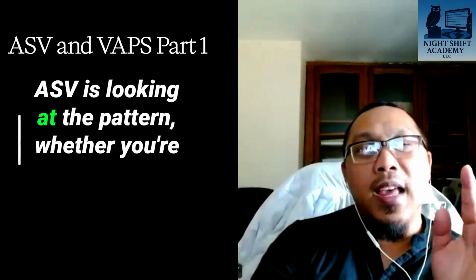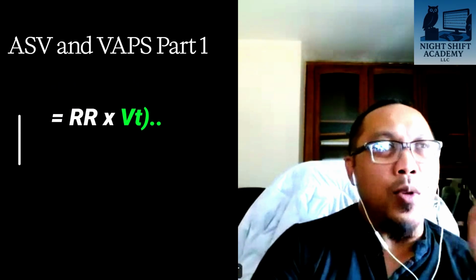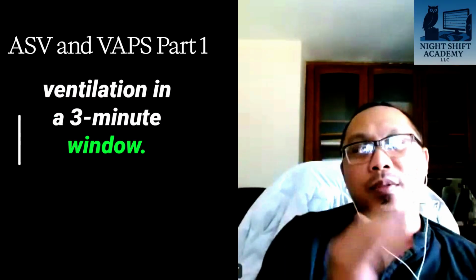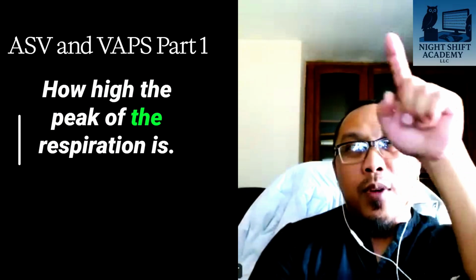ASV is looking at the pattern, whether you're using Philips or ResMed. One will look at minute ventilation, meaning respiratory rate and tidal volume. It will look at the patient's own minute ventilation in a 3-minute window. Philips will look at the patient's own peak flow, how high the peak of the respiration is.